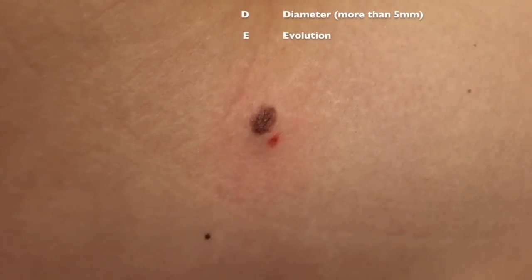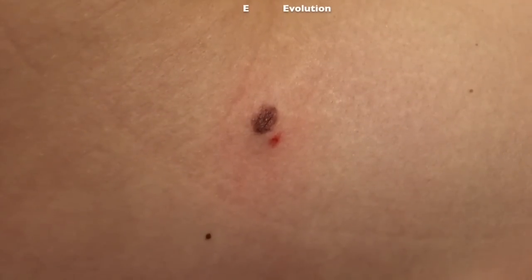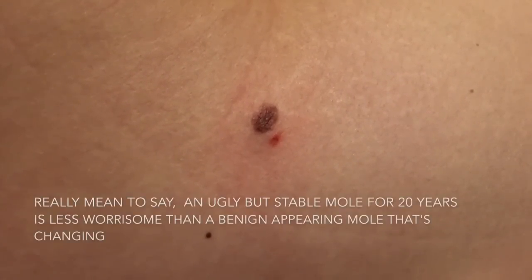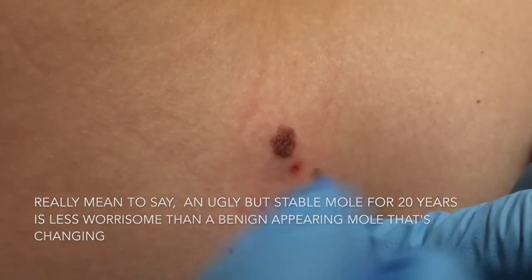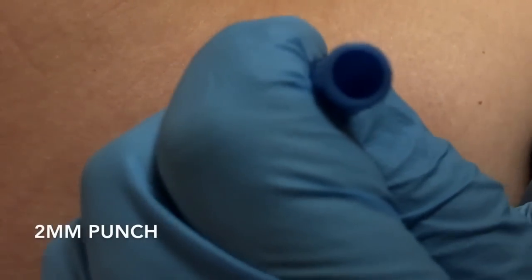E is the evolution, which is really the most important part. If you have the ugliest mole in the world, we don't really care — we care if it's changing. So what we're going to do is: I've already cleaned this with chlorhexidine, and we're going to use a little punch, going right to the edge where there's new growth.